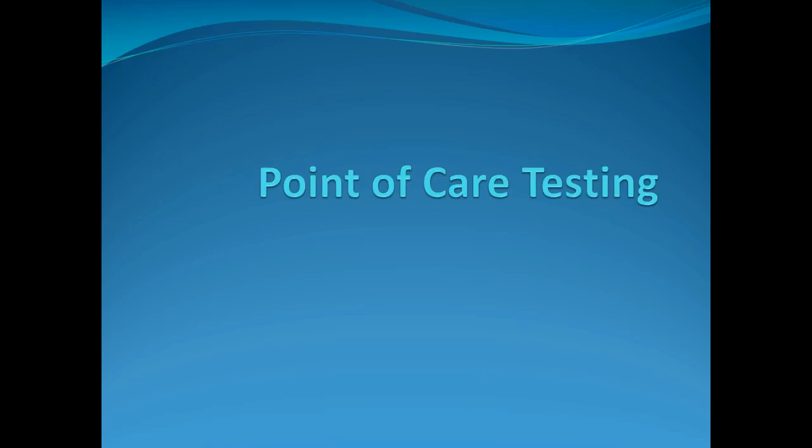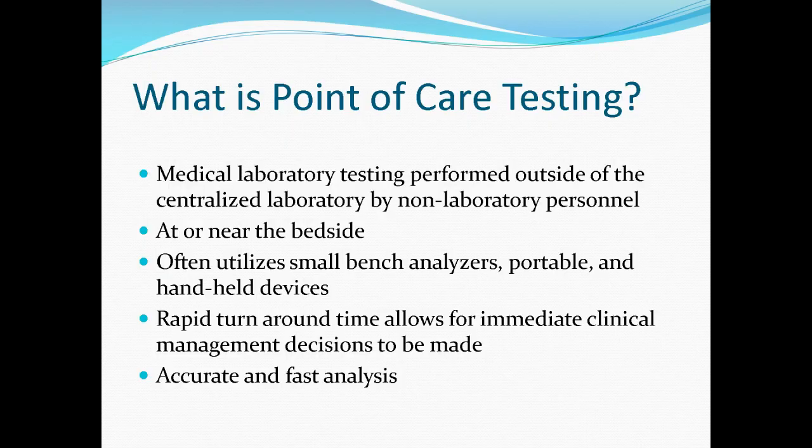This is a brief overview of point-of-care testing. Point-of-care testing is laboratory testing that is performed outside of the centralized laboratory, oftentimes by non-laboratory testing personnel. It can be done at or near the bedside and often utilizes small benchtop analyzers that are portable and most often handheld devices. It allows for a rapid turnaround time so clinicians can make immediate decisions. It offers accurate and fast analysis.